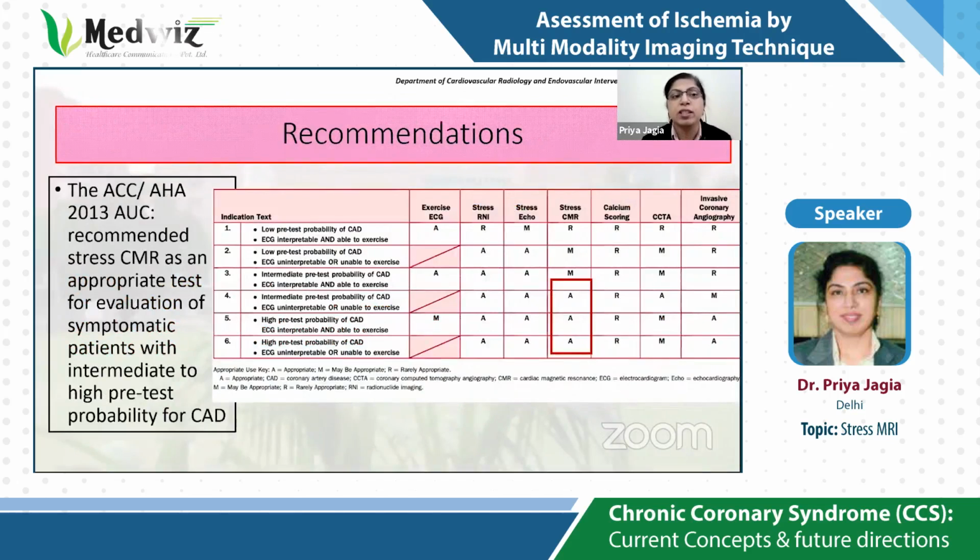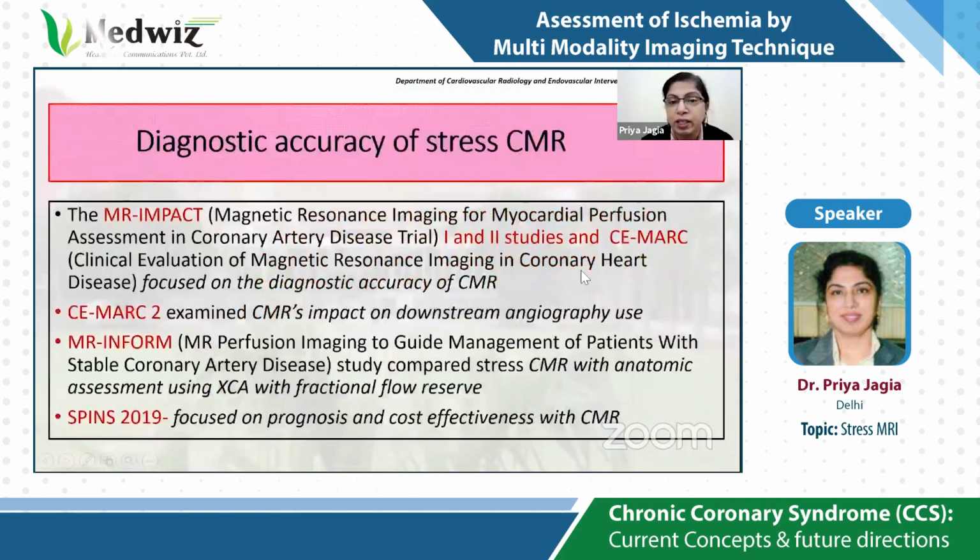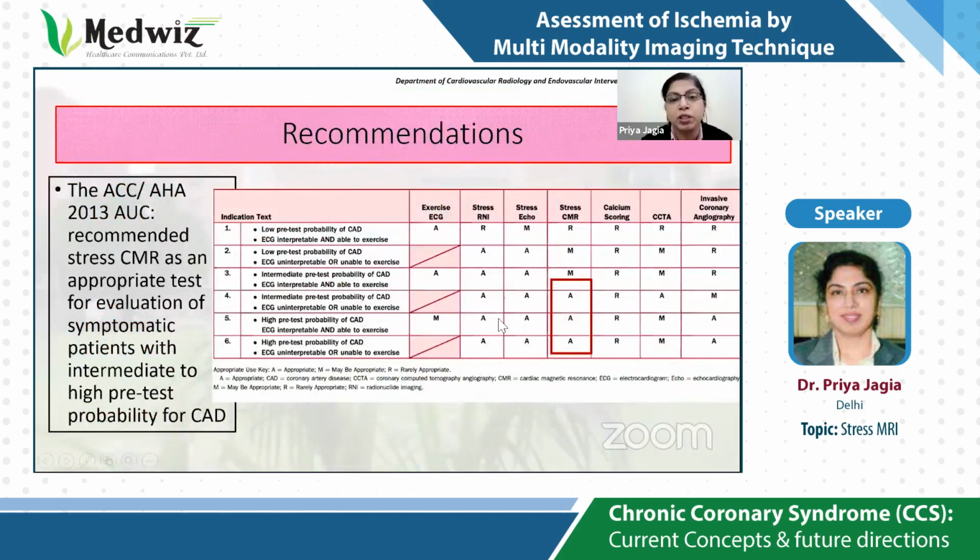And because of this, in the ACC 2013 guidelines, it was recommended as an appropriate test for the evaluation of symptomatic patients who have an intermediate pre-test probability of CAD, alongside the stress echo and the radionuclear stress tests.